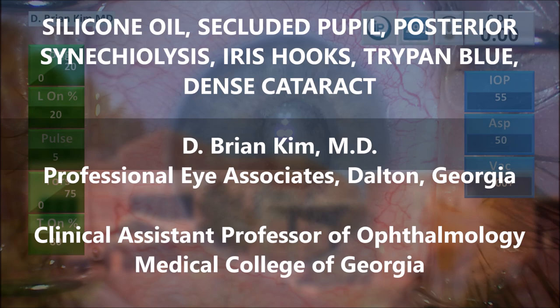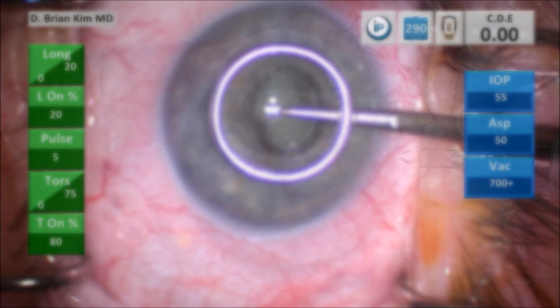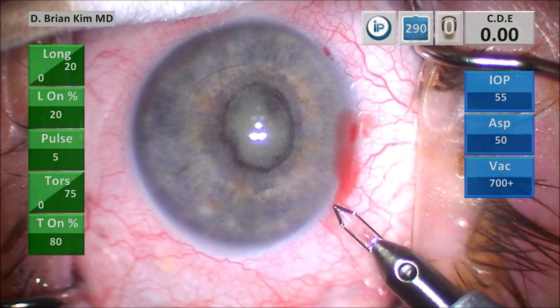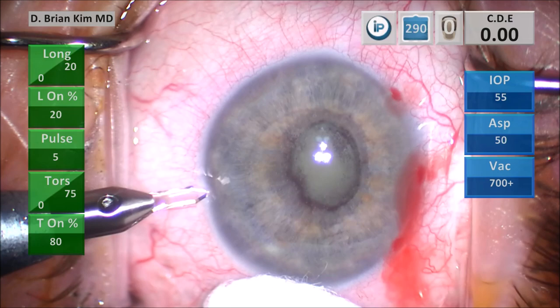You can see this small and secluded pupil with irregular borders and pigmentation around the pupillary edge, and pigment on the anterior capsule. I'm going to place my corneal mark to help me center and size my capsulorhexis and make my paracentesis incisions. I'll make them flat to the iris plane, which helps ensure a self-sealing incision. I'm also putting incisions for my iris hooks. You can see tiny little droplets of silicone in the anterior chamber over the pupillary edge — microscopic bubbles of oil.